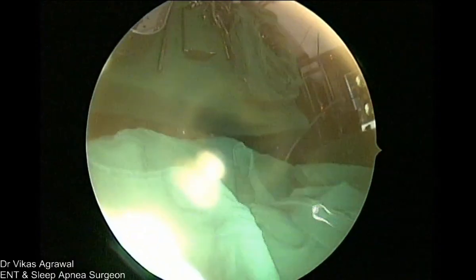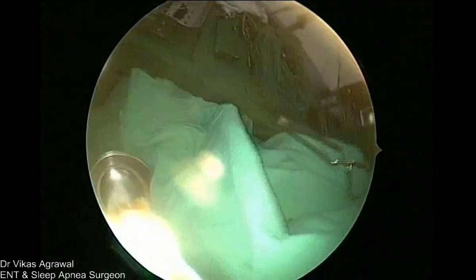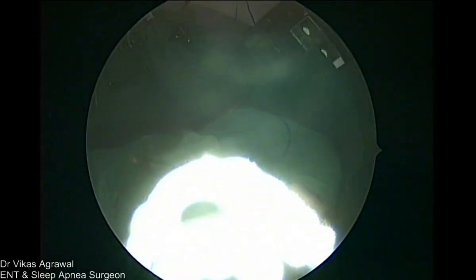And now this is going to bleed. Give me debrider. So I'll debride the, I have not injected into the turbinate, so it's going to bleed.